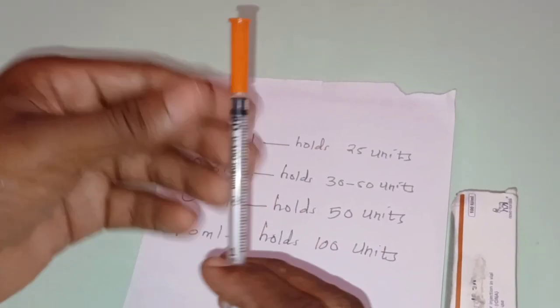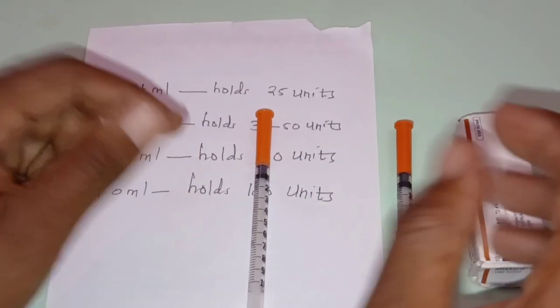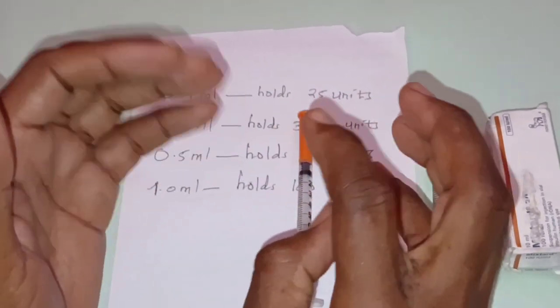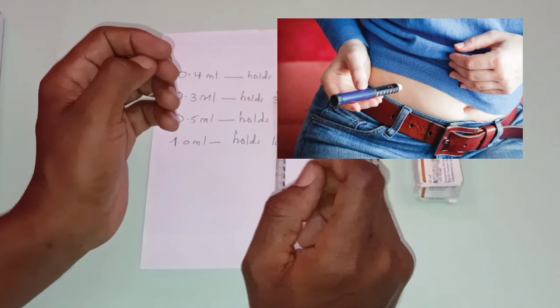Okay, how are you going to administer the injection? What about the injection site of the insulin? Insulin injection is generally given subcutaneously, that is immediately below the skin, in the subcutaneous layer. What about the injection sites?